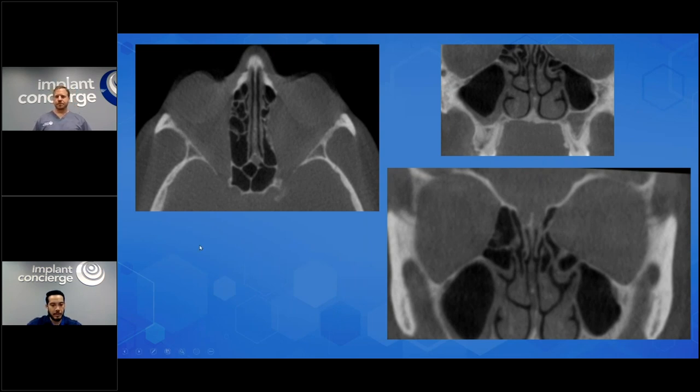All right, and then in an unrelated question, we have a doctor asking, are Hounsfield units applicable in CBCT as in traditional CT in assessing bone quality, particularly in assessing an implant site? No, that is the big difference. There are multiple pre-patient, post-patient screens that adjust the dose and the radiation when it comes to the traditional CT or multi-detector CT. It's MDCT because multi-detector or helical.